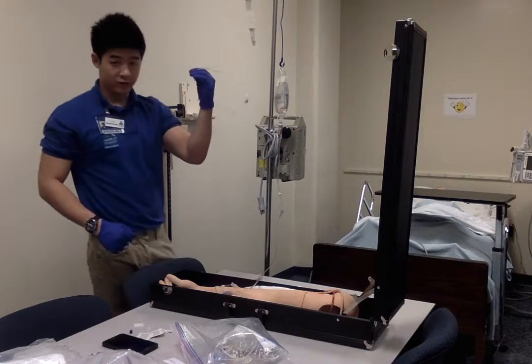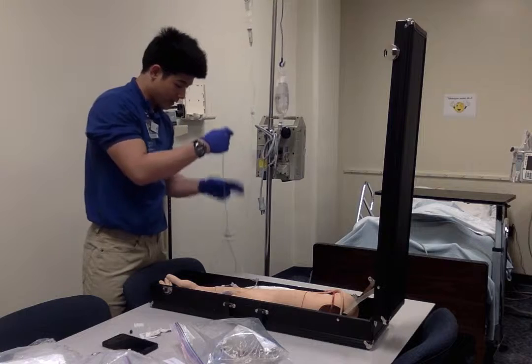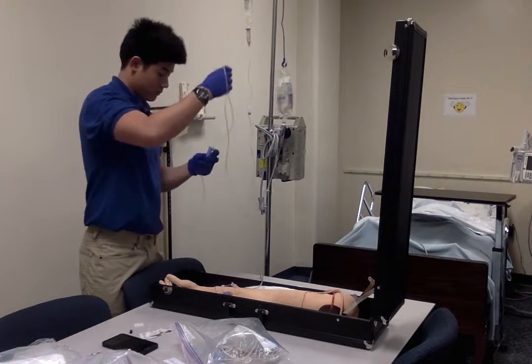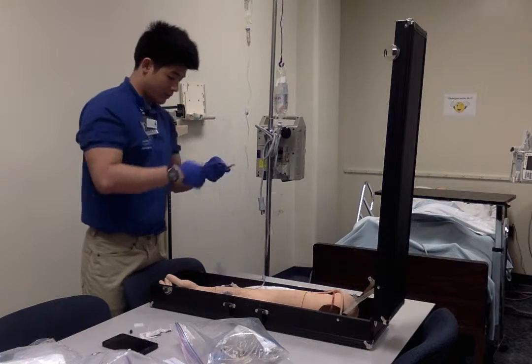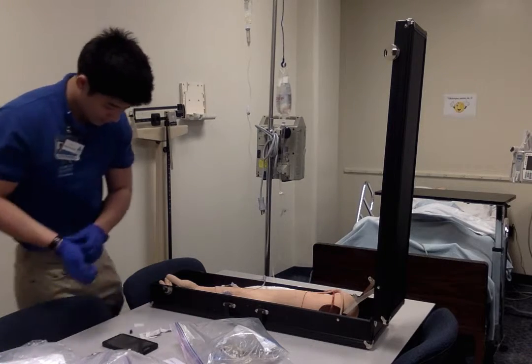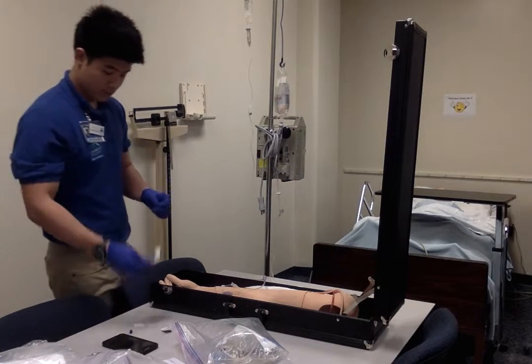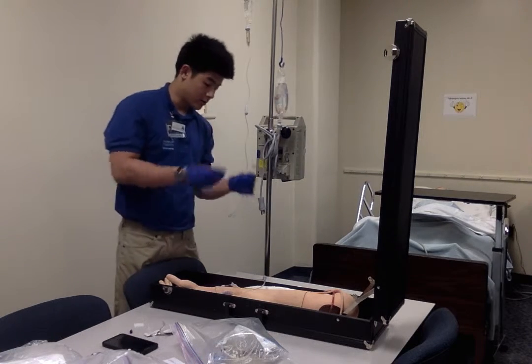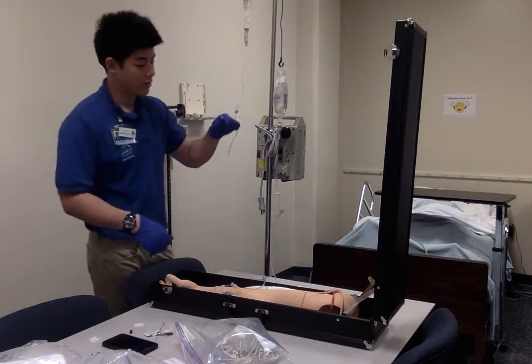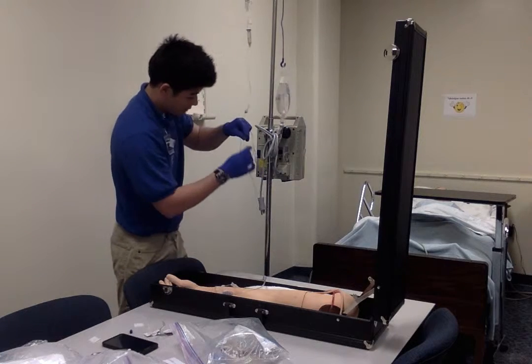Cut the one on the top. All right, so this part is still sterile. So what I'm going to do is stop the flow right here for the primary line. So clamp it. And then after that, I'm going to have to clean the port of the primary line. Clean it. This one was supposed to have a cap, so I'm going to assume that this had a cap, which is a piggyback, and go ahead and attach.